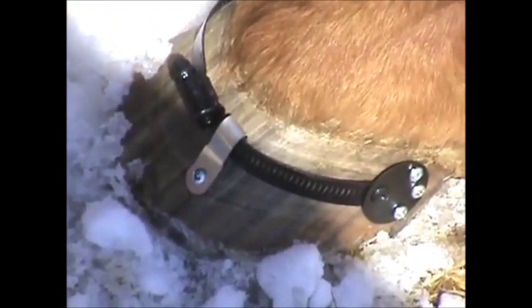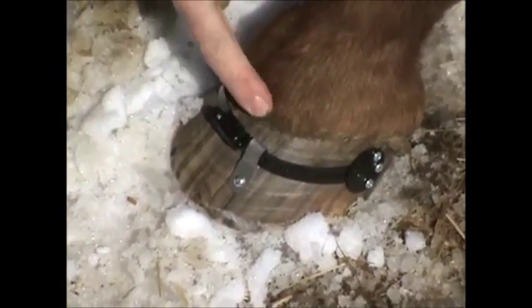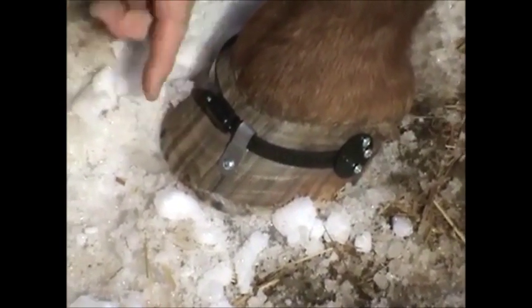These things relieve the pain almost instantly, but we have to wait for the hoof to grow. And you can actually see — when we do this — there's going to be a change in direction. See how nice and straight these are right now down the front here? When we're done, before we're trimming everything, everything below this will be coming out this way, and this part here is going to be growing straight down.